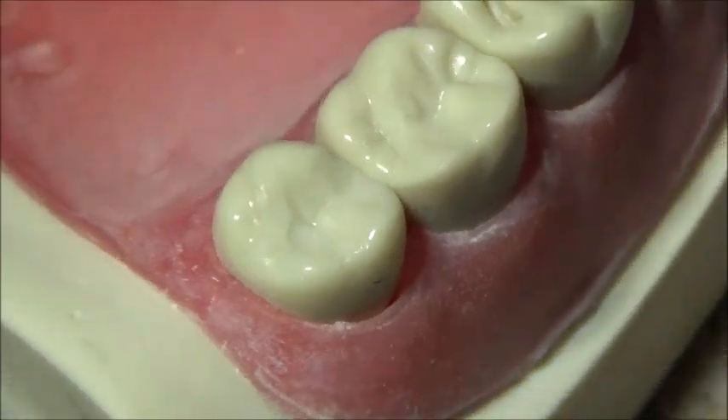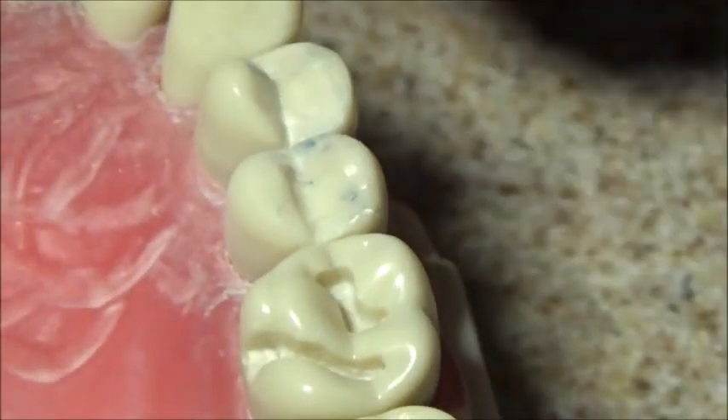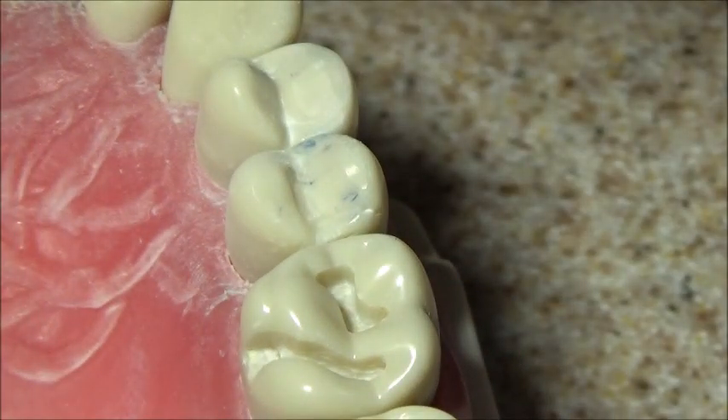I'll go ahead and pause this portion of the video and get set up to place the composite in.